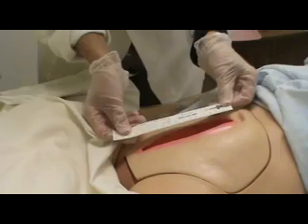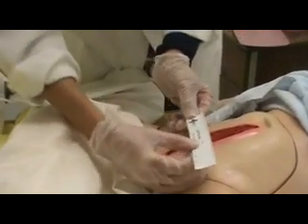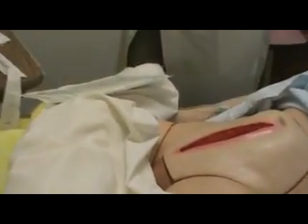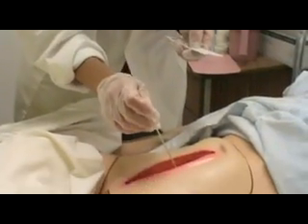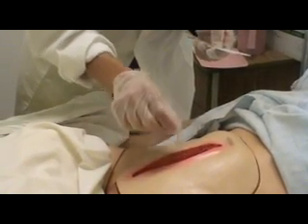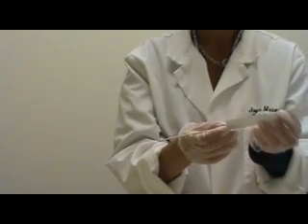I take my measuring tape and ever so carefully, without touching the wound, I'm going to eyeball — that looks like 14 centimeters long by 2.5 centimeters wide. Now I take my cotton tip applicator and I'm going to put it in the wound ever so gently. I'm not going to jam it down, and I'll go to the top part of the wound and measure the depth — that looks like about two and a half centimeters deep.